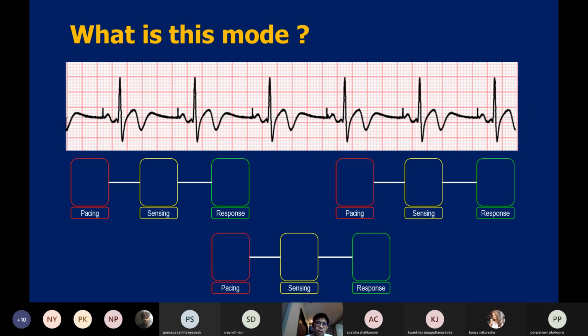If the pacemaker also has a trigger response, you will see that if there is a P wave in front of a QRS coming along, and it stimulates the RV lead, the pacemaker will respond by triggering itself and pacing on the intrinsic.